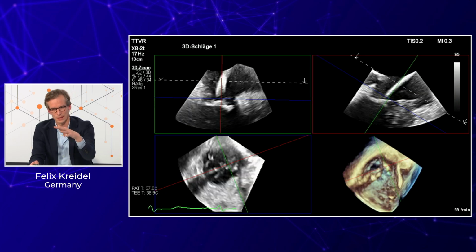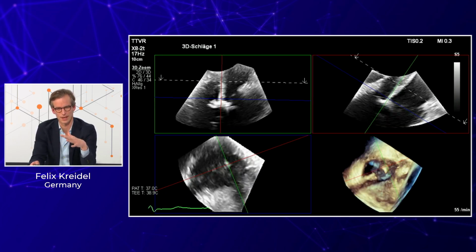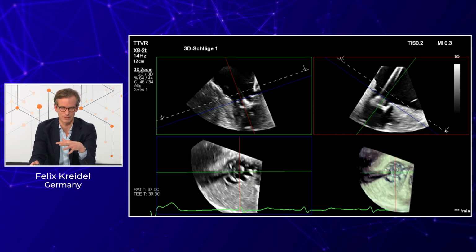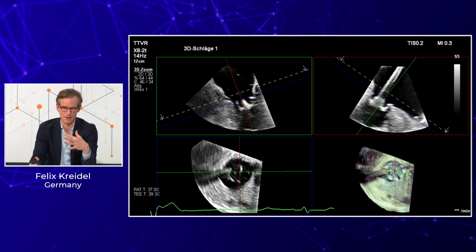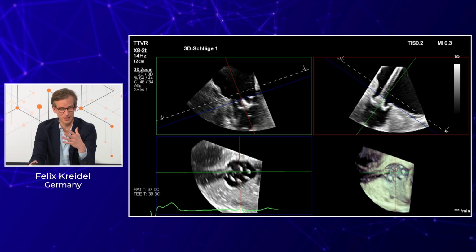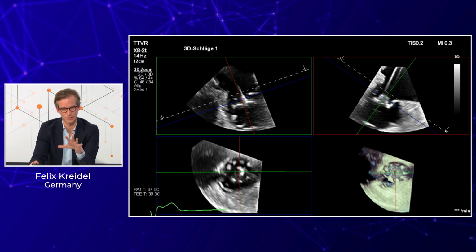If I jump to the next slide, you see that they have already developed further and start to interact with the leaflets, and then you make them flip. And this is where this device works similar to a TEER device, actually, as it tries to grasp leaflets, and you can understand that we were pretty interested in how this valve would grasp that deteriorated posterior leaflet.